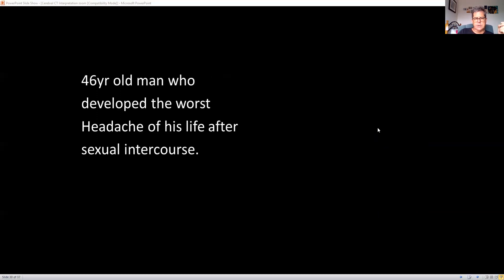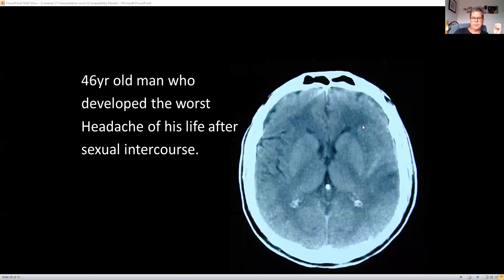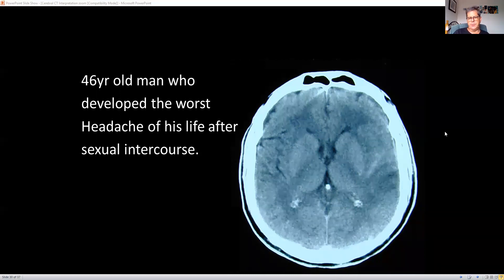A 46-year-old man with the worst headache of his life after sexual intercourse. Not immediately obvious, but if you look at the sylvian fissure and sulci on this side compared to the other side, you can see there's blood inside there. It really shouldn't be missed.